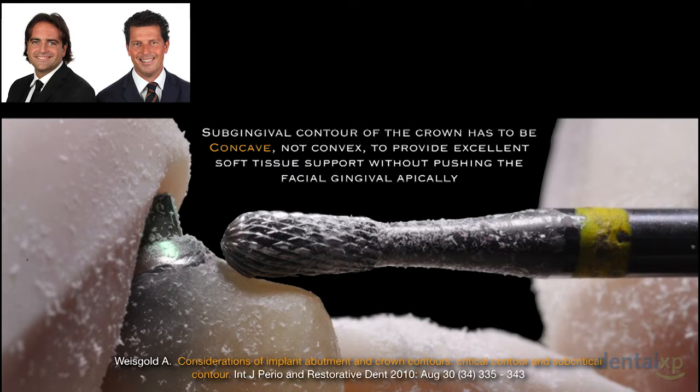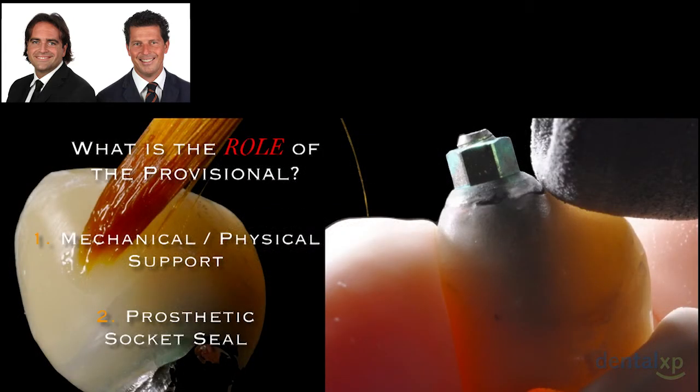Managing properly the critical and subcritical emergence profile of the provisional restoration is a crucial part of the treatment process. And also smoothing and steam cleaning. It will help the provisional itself to fulfill its role, supporting the soft tissue mechanically and physically, and sealing the socket, protecting the graft inside, avoiding possible infections.